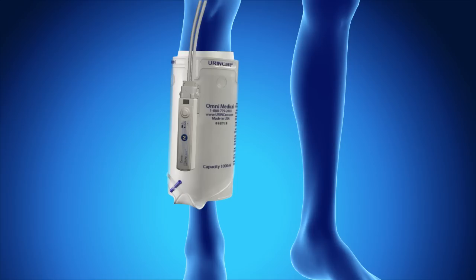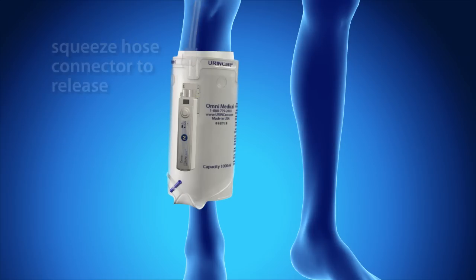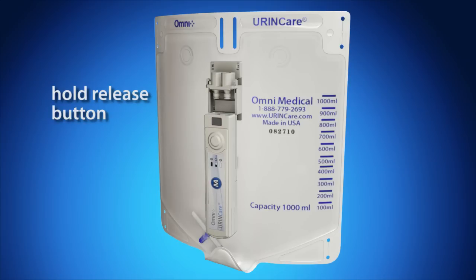To remove the hose from the control device, squeeze both sides of the connector and pull away from the control device. To remove the control device from the collection chamber, press and hold the black release button located at the top of the device and slide away from the clip.